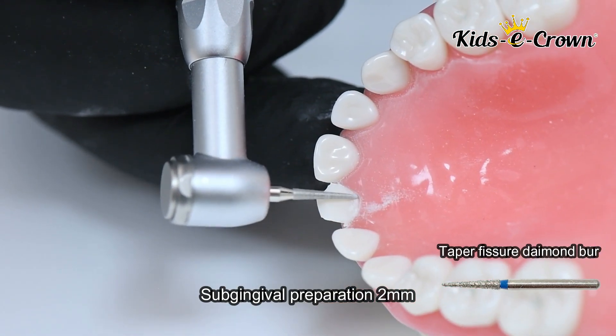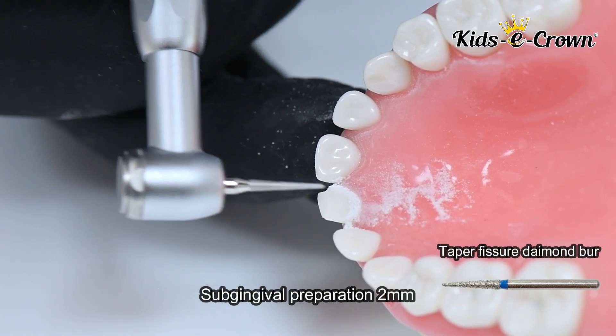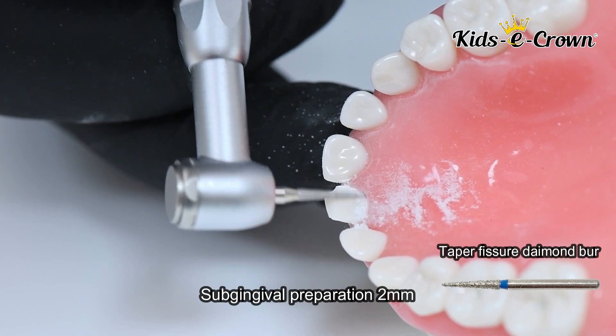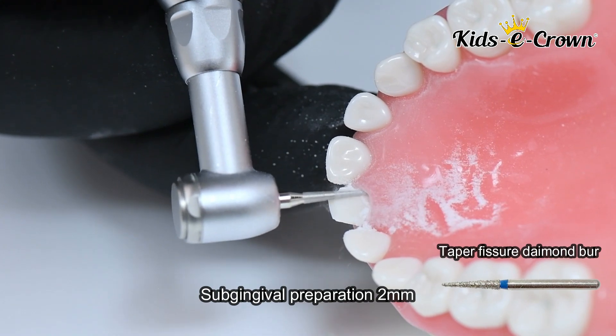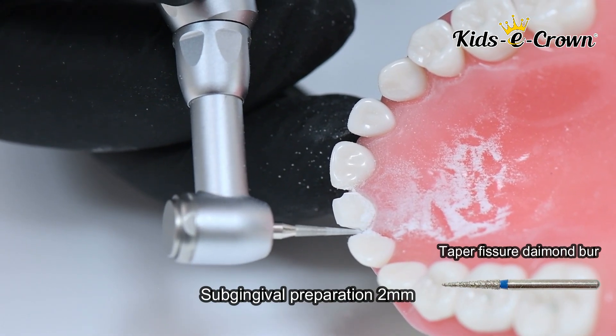Here you can see how the tapered fissure burr goes 2 mm sub-gingival and removes the finish line in both the buccal and the lingual areas.